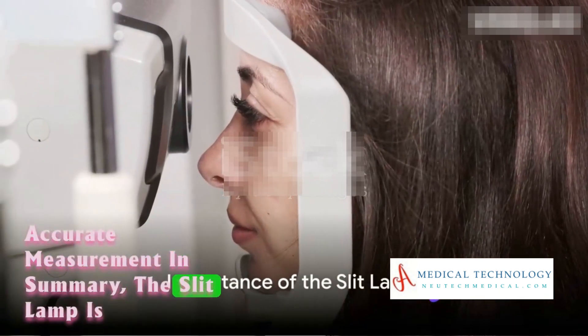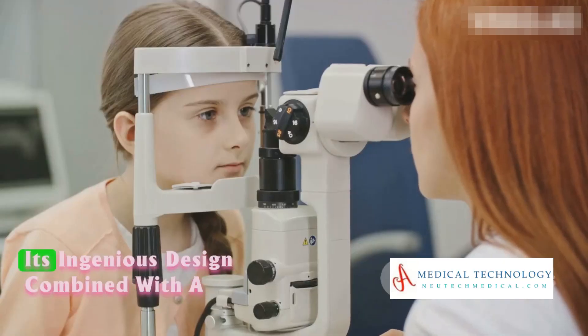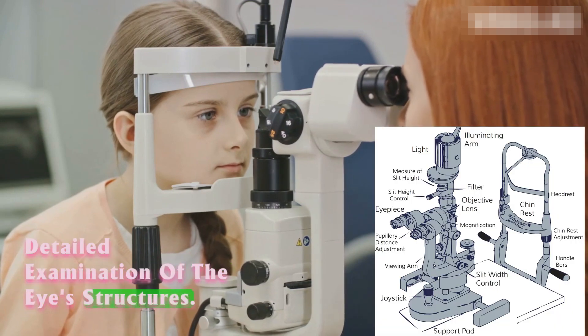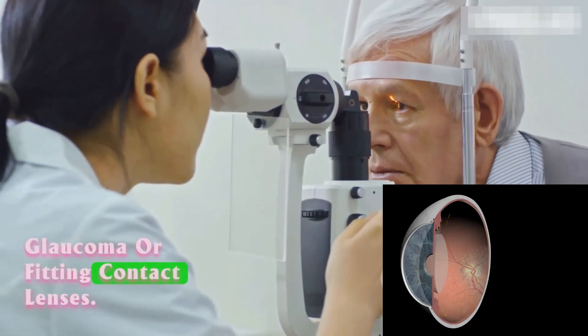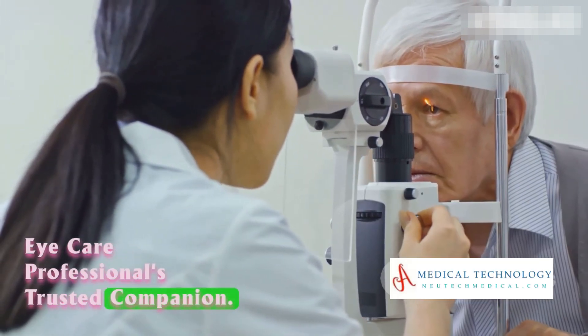In summary, the slit lamp is an indispensable tool in eye care. Its ingenious design, combined with a high-intensity light source, allows for detailed examination of the eye's structures. Whether it's diagnosing cataracts, assessing glaucoma, or fitting contact lenses, the slit lamp is the eye care professional's trusted companion.